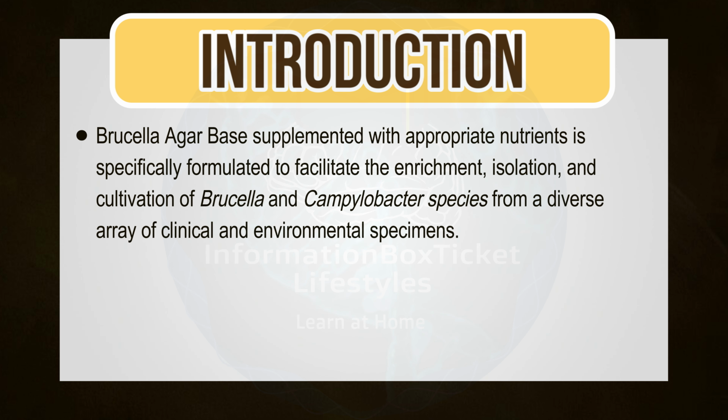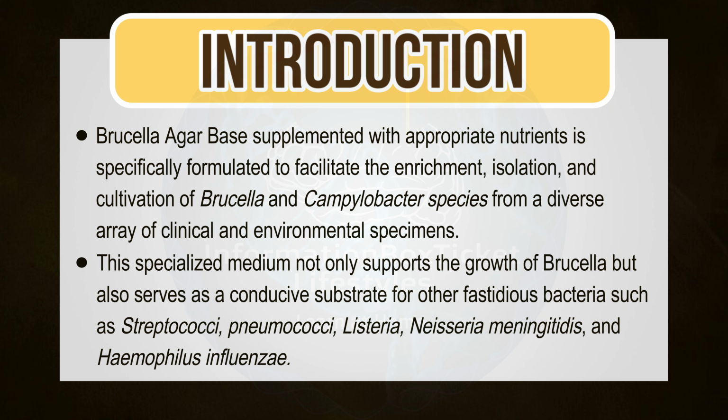Brucella agar base supplemented with appropriate nutrients is specifically formulated to facilitate the enrichment, isolation, and cultivation of Brucella and Campylobacter species from a diverse array of clinical and environmental specimens. This specialized medium not only supports the growth of Brucella, but also serves as a conducive substrate for other fastidious bacteria such as Streptococci, Pneumococci, Listeria, Neisseria meningitidis, and Haemophilus influenzae.